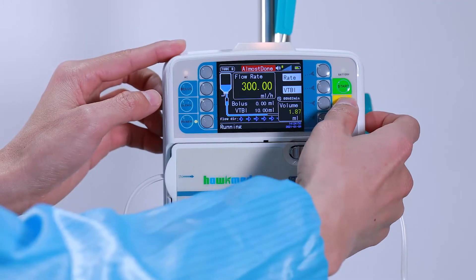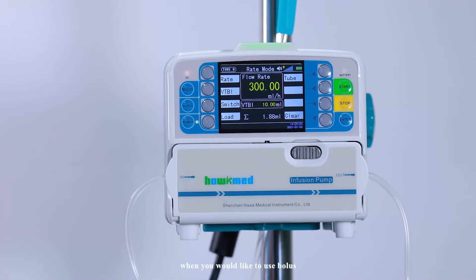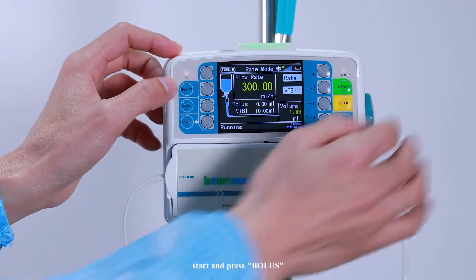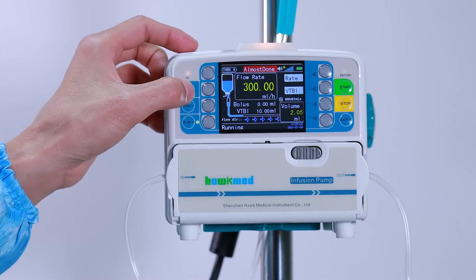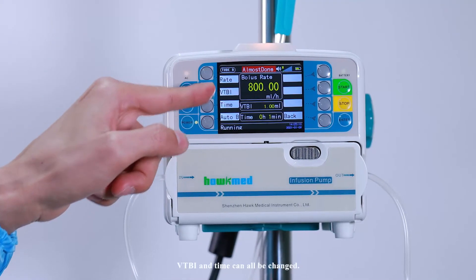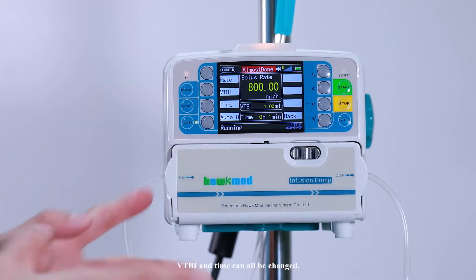Stop the infusion. When you would like to use bolus, press Start and then press Bolus. The flow rate, VTBI, and time can all be changed.